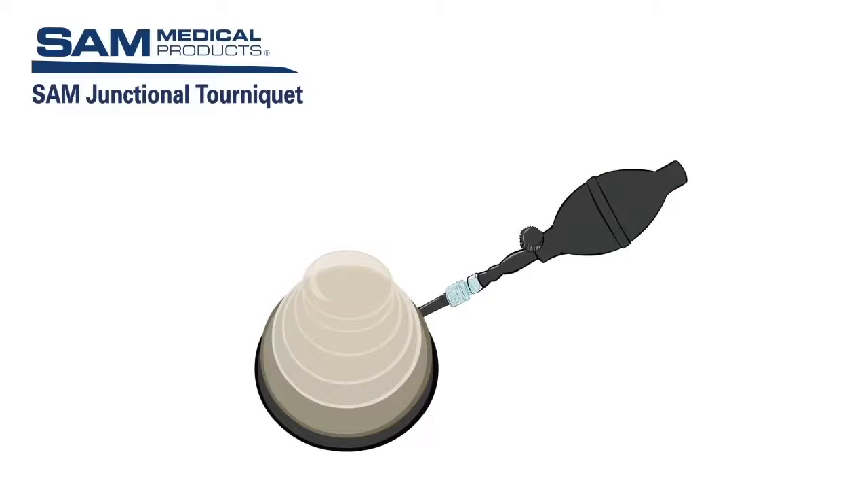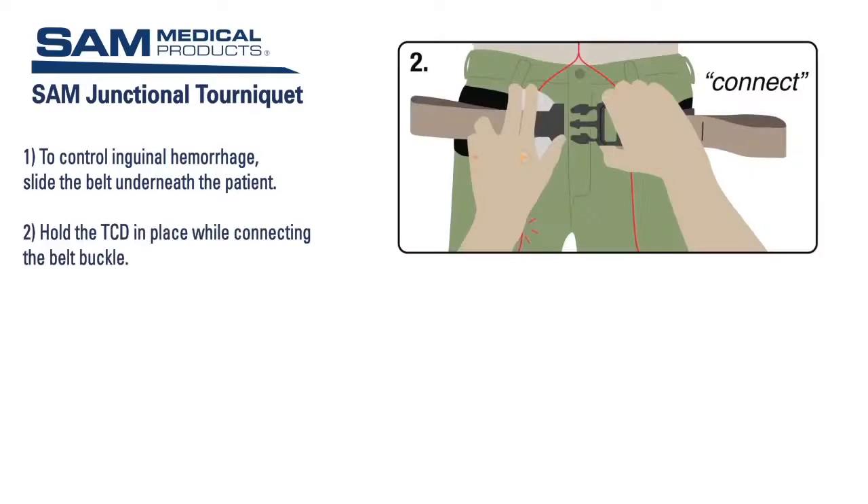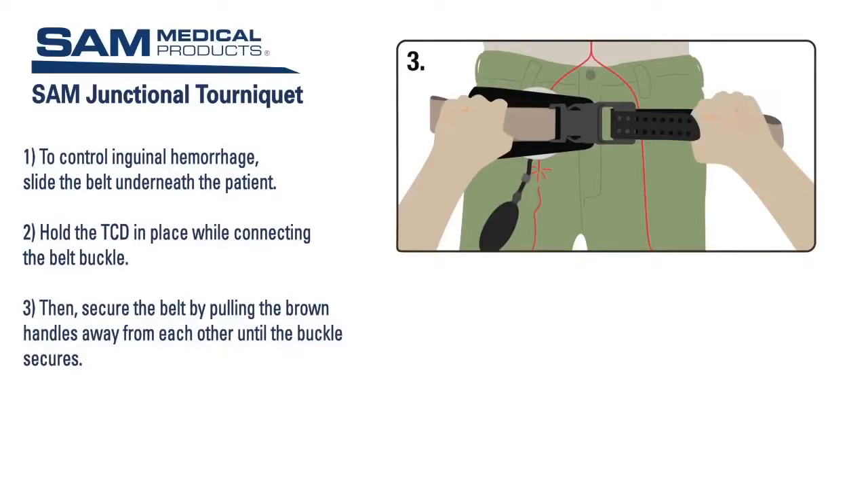It is easy and quick to inflate using the hand pump. To control inguinal hemorrhage, slide the belt underneath the patient. Position the TCD over the area to be compressed. If the TCD will be directly on an open wound, use sterile gauze or a hemostatic dressing to cover the contact area. Hold the TCD in place while connecting the belt buckle, then secure the belt by pulling the brown handles away from each other until the buckle secures.